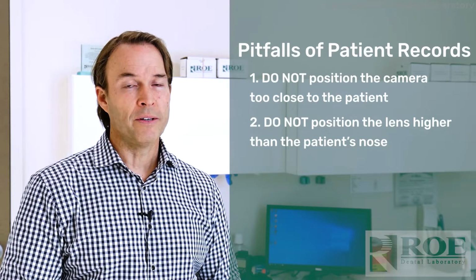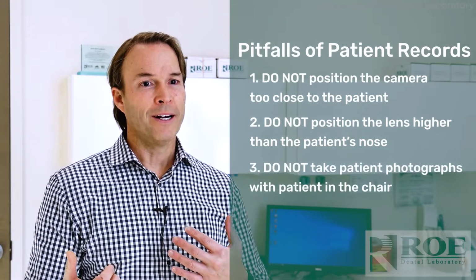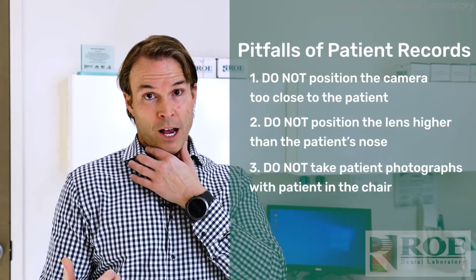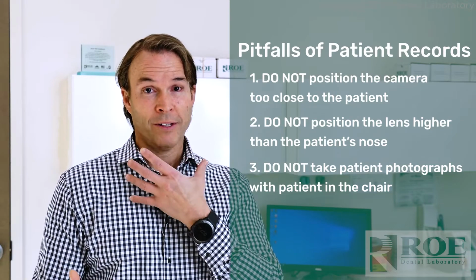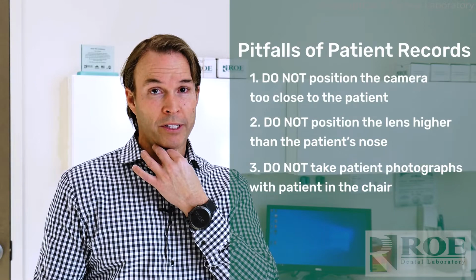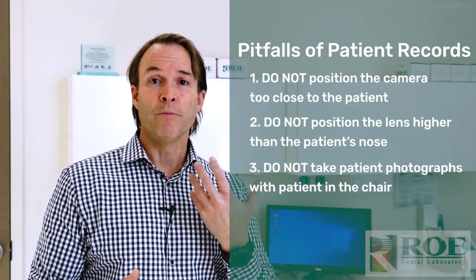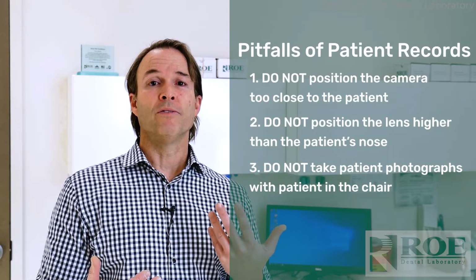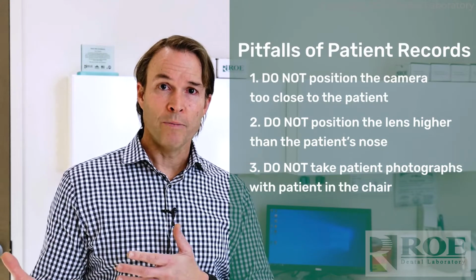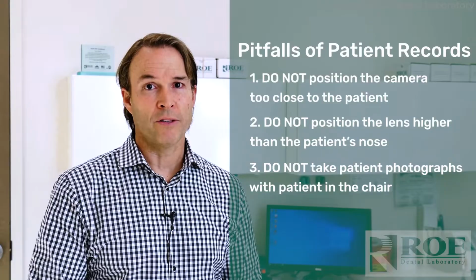Another is often photographs are taken full face in the chair, and then a patient is usually contorting to look over to the camera, or they're tipped down, and then they have a little chin going on that they don't like. It's tough to make a smile simulation that way, and then often even the musculature, gravity, everything is just different when a patient is lying back in a chair. So standing up against a wall, horizontal, just like all the parameters that we discussed, are the best photographs.